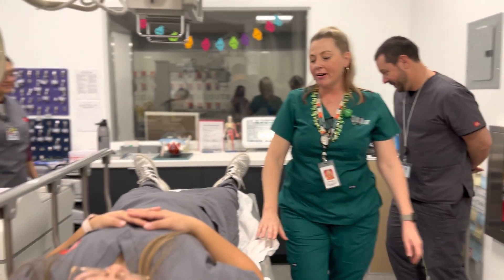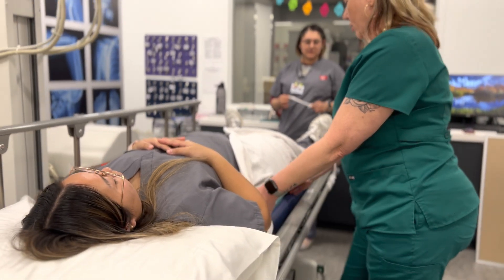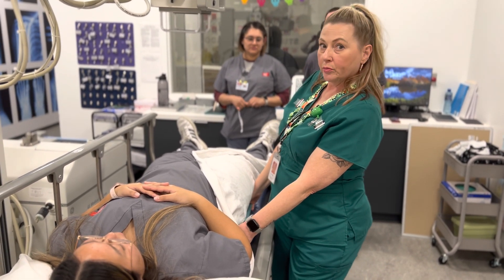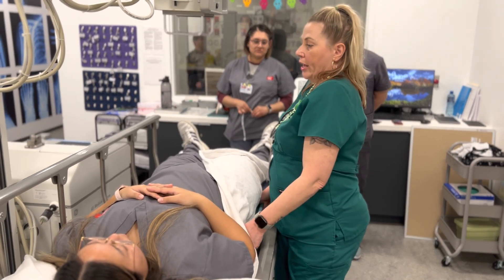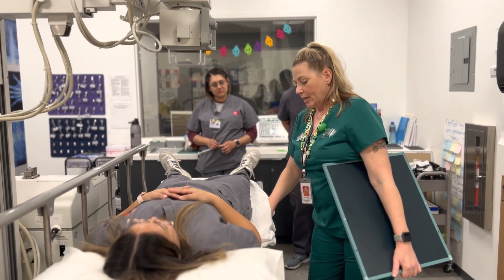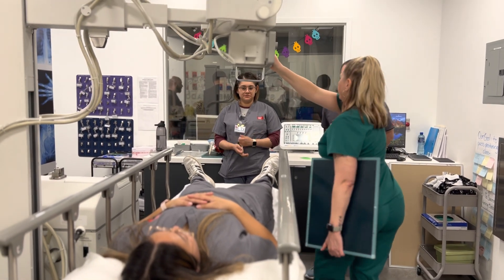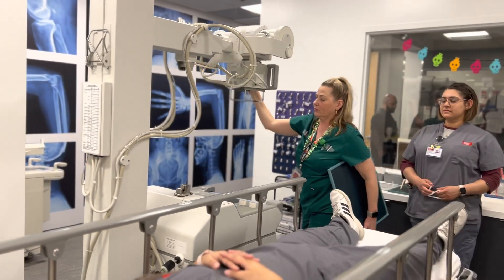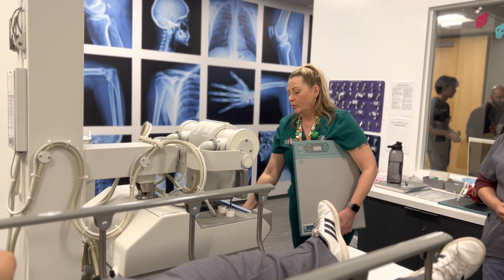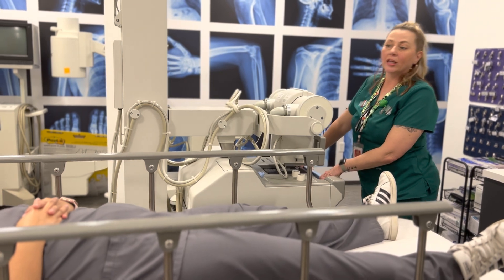85 at 25. I take this out, step back, and say, 'X-ray! Go ahead and hold your breath.' I expose, then say, 'And breathe.' Then I go in reverse. When I'm done, I bring up the rail — watch your arms. I put the requisition back in the portable. Then I say, 'I'm all done. I hope you feel better soon. Thank you so much. Bye.'